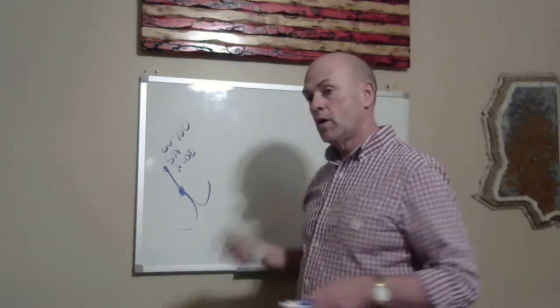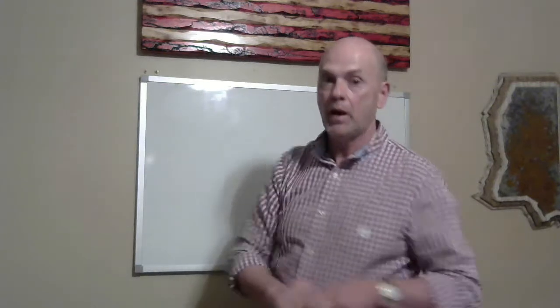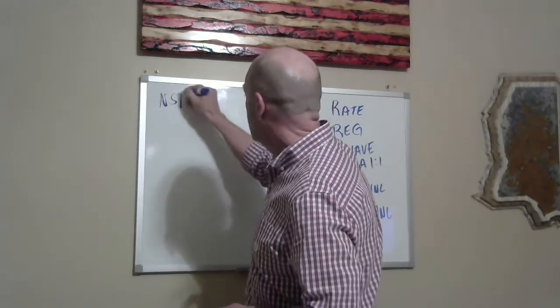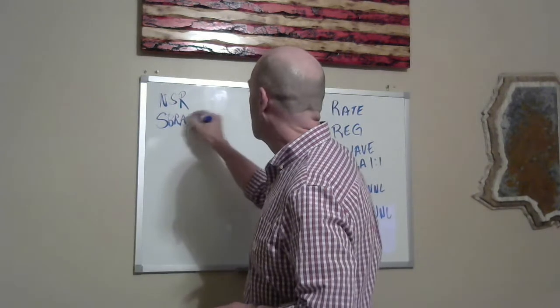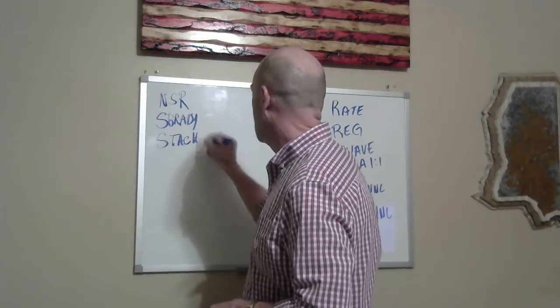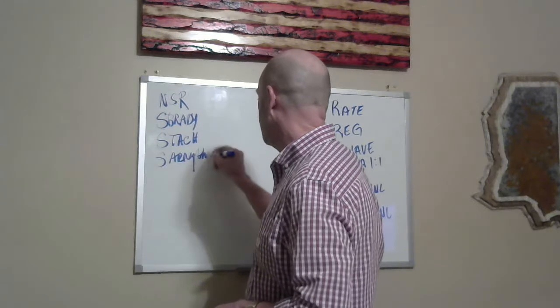So before we start the sinus rhythms, how about we name all of them first? Normal sinus rhythm, sinus Brady, sinus tach. There is a sinus arrhythmia. That's its name.